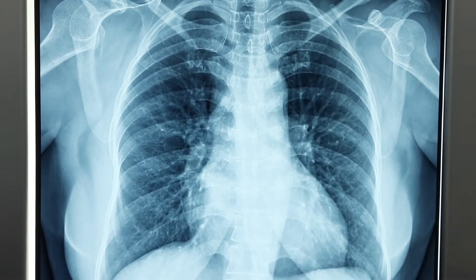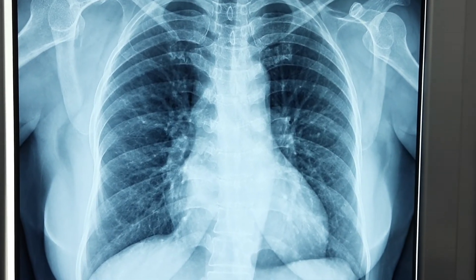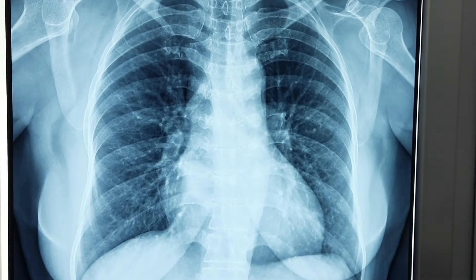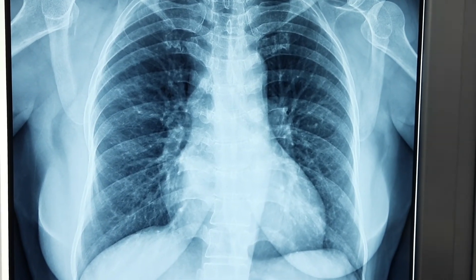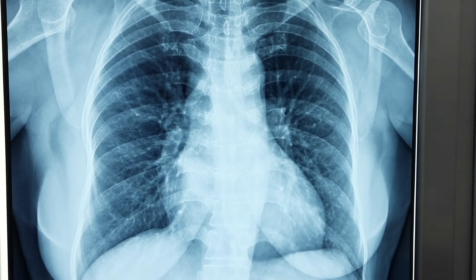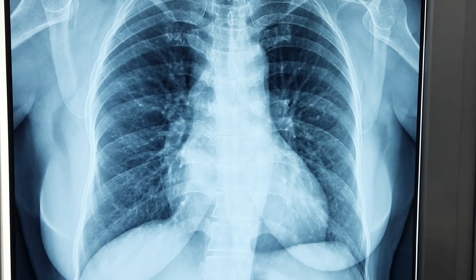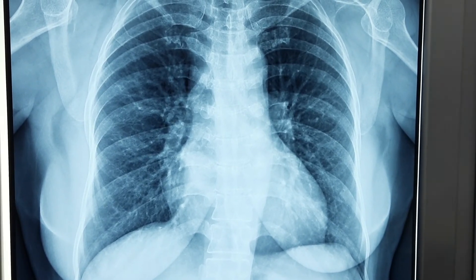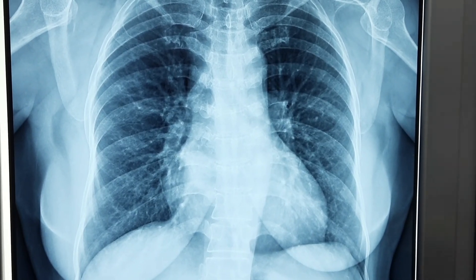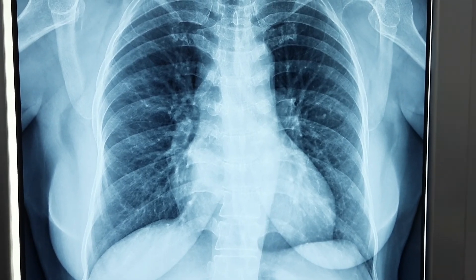X-ray chest PA view showing transverse diameter of cardiac shadow increased. Diagnosis is cardiomegaly, left ventricular type of enlargement of cardiac shadow. Cardiomegaly, left ventricular type.